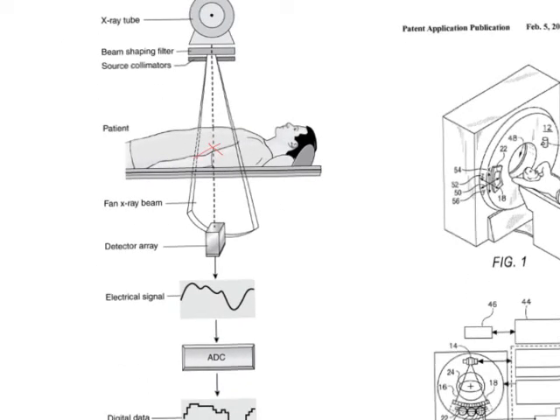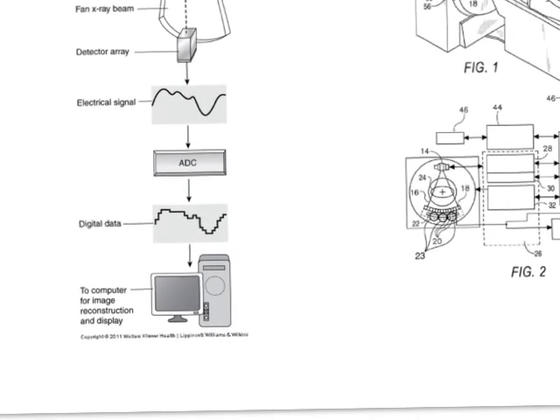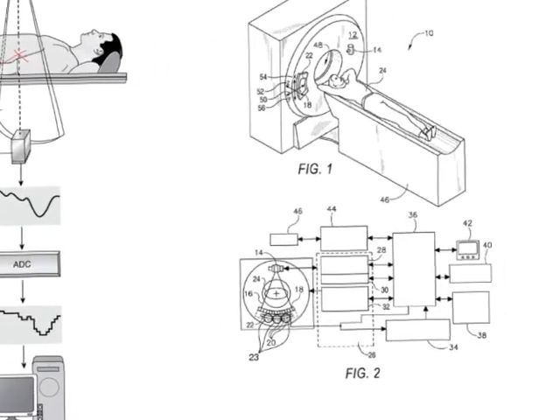So nothing new there, right? That produces an electrical signal that's then fed into an ADC, right? And that's just an analog to digital converter. An ADC is an analog to digital converter. It takes an electric signal, an analog signal, and converts it to digital. So it goes in electric, comes out digital, and then the computer crunches all those numbers. Okay? That's all we're talking about, right? That's what the hardware is.